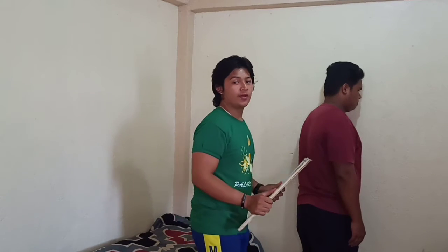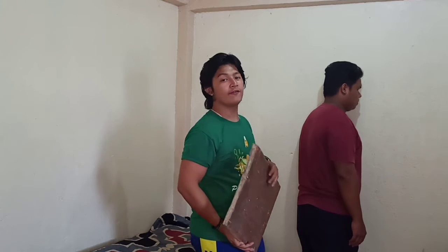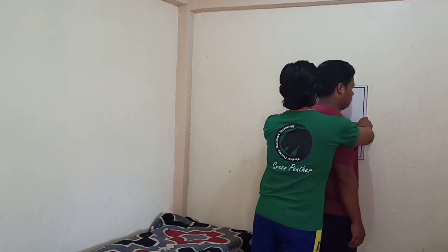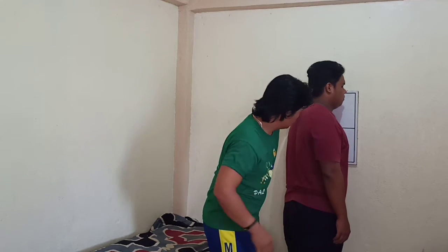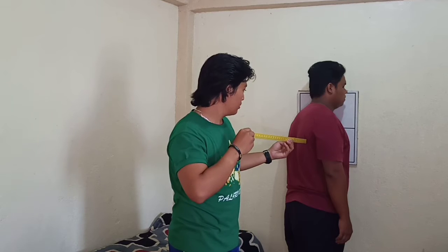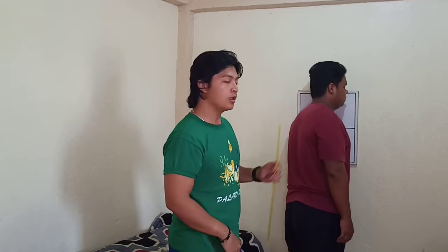Use a 14/17 image receptor and center the image receptor at the level of the T7. The central ray must be perpendicularly directed at the level of the T7. The structure shown in this projection is the zygapophyseal joint closest to the image receptor.